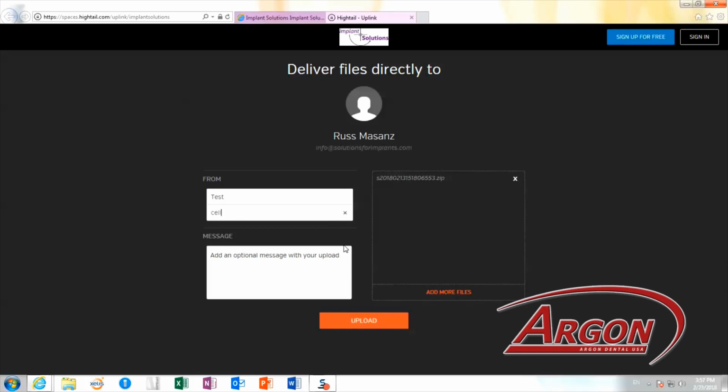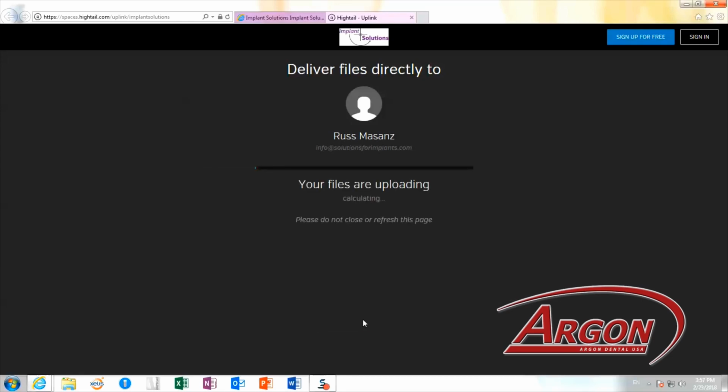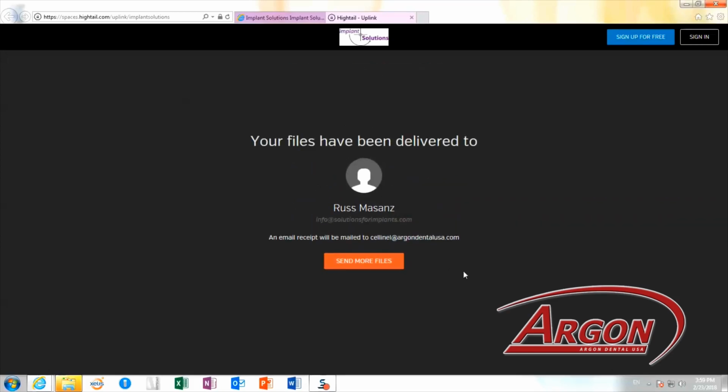Insert your information, doctor's name and email, and add any other information that you pertain important, like patient name, tooth position, implant system, and if needed and important, the date of surgery. Once the files are uploaded, they will show up as an email to the Implant Solutions staff.